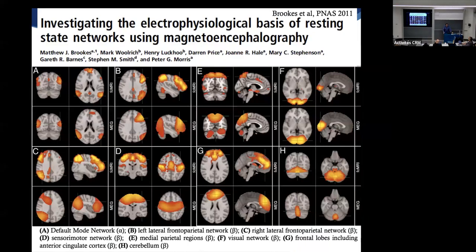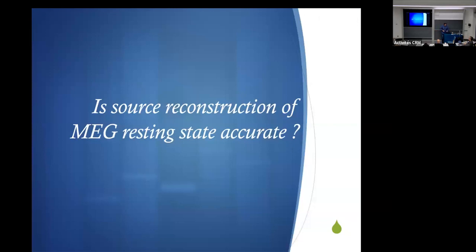I showed you that this morning, saying that if you look at the correlation of the envelope of your signal, you have a structure of interest. It's been discussed, and there are contradicting results so far recently, but it looks like you have patterns that look a little bit like fMRI networks, not similar, but there is clearly a structure. So you reconstruct your data, you filter in a specific band, and then you correlate the envelope. So you can do seed-based analysis. What we did is we tried that using MEG.